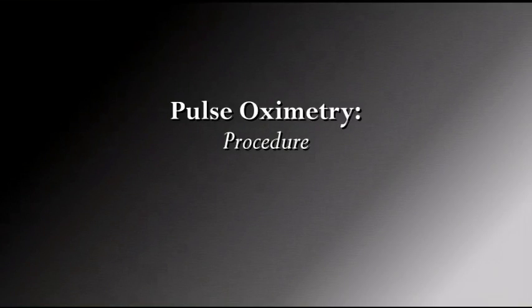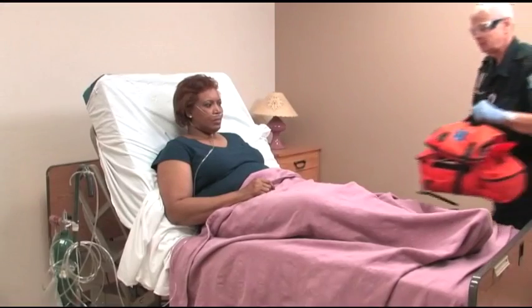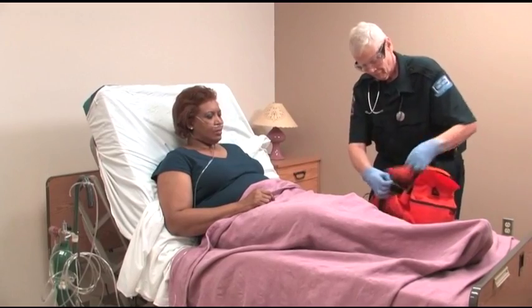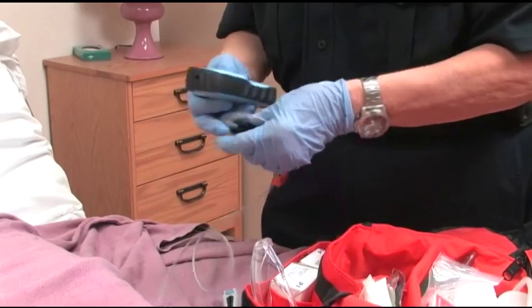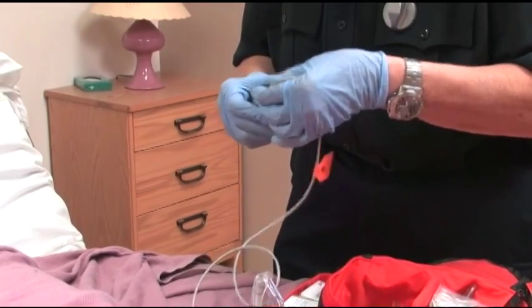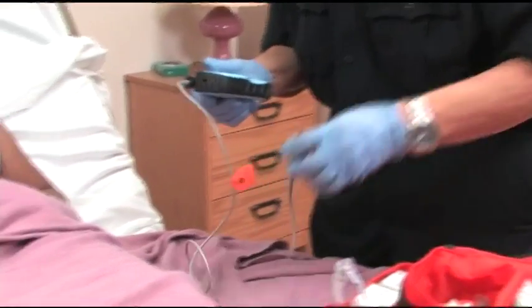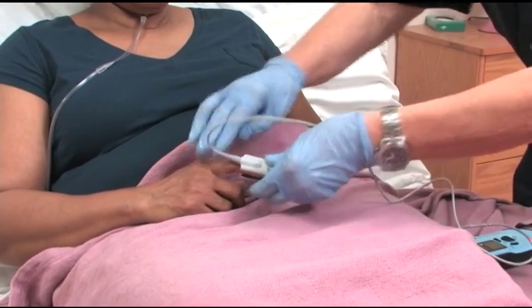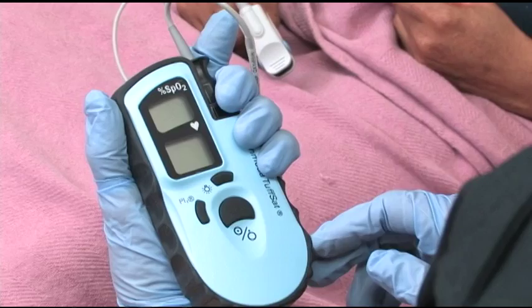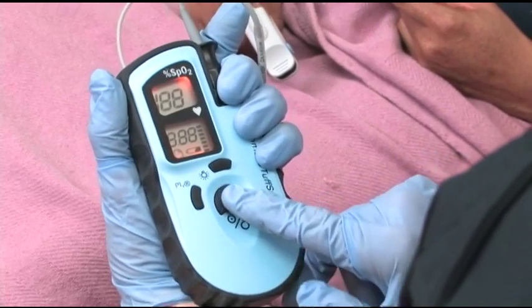Now let's take a look at the steps involved in pulse oximetry measurement. Take BSI precautions. Select the appropriately sized sensor. Connect the sensor lead to the monitor and clip the sensor probe to the patient's fingertip. Turn on the pulse oximeter. Observe for the SpO2 and heart rate.